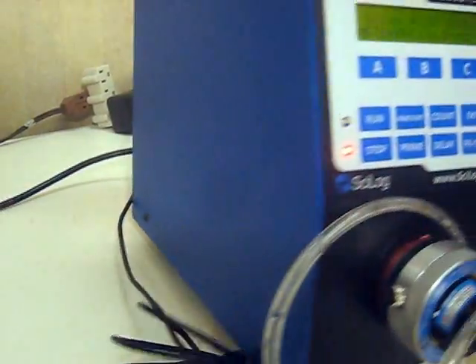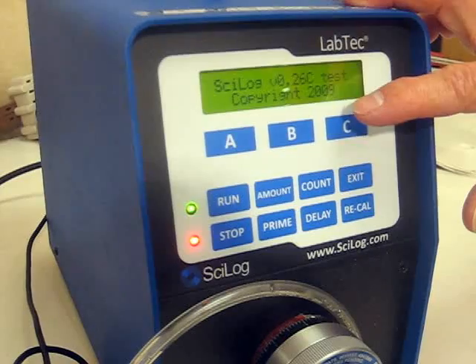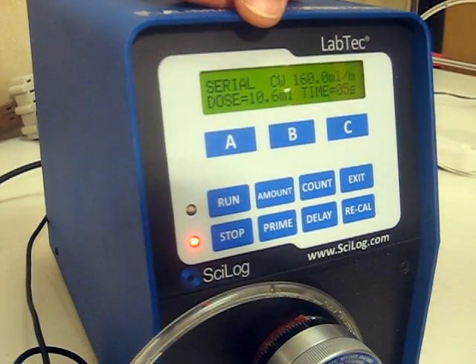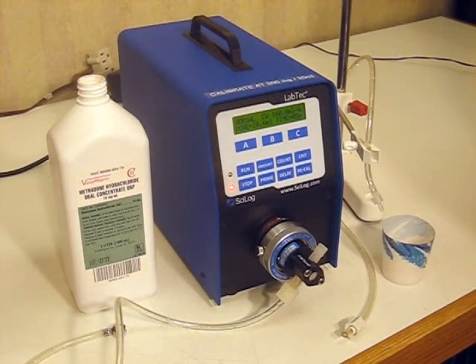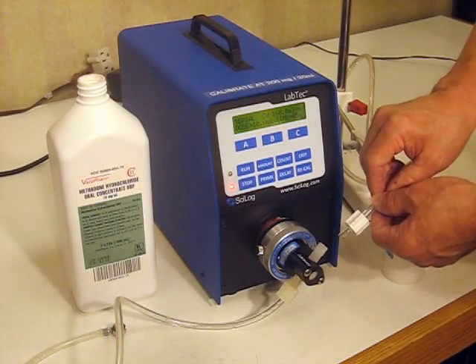That will then go through a pattern of checks and balances, and you will then come to the major screen showing the serial port. Now that the cables are connected, let's move on to connecting the tubing to our piston head.